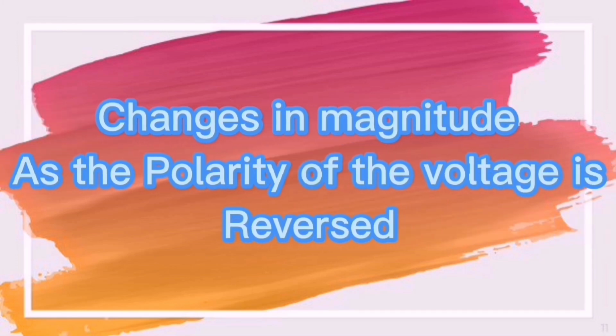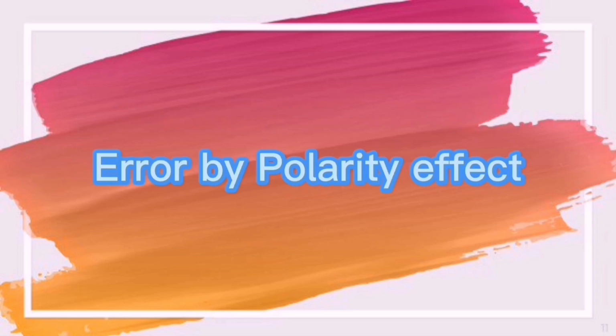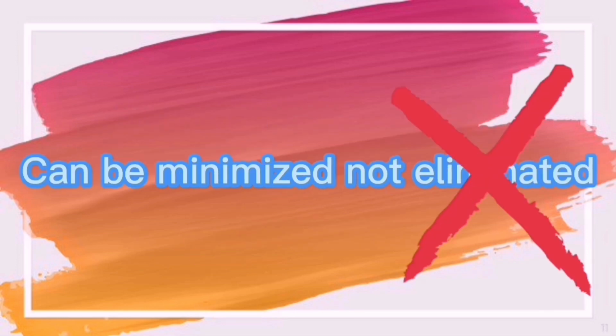The polarity effect is caused by the changes in magnitude as the polarity of the collecting voltage is reversed. The errors caused by polarity effect can be minimized but cannot be eliminated. Therefore, the polarity effect should be less than 0.5% for any radiation beam.